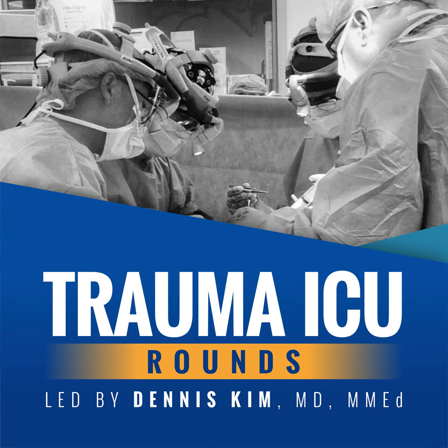the peak alveolar pressure. Put more simply, in pressure ventilation, we set a pressure, or the peak alveolar pressure, as the independent variable. Therefore, pressure remains constant, whereas volume will vary based on changes in the lung characteristics. Unlike volume ventilation, where we must monitor changes in peak airway pressures, here pressure is set and we must therefore monitor volume delivery.